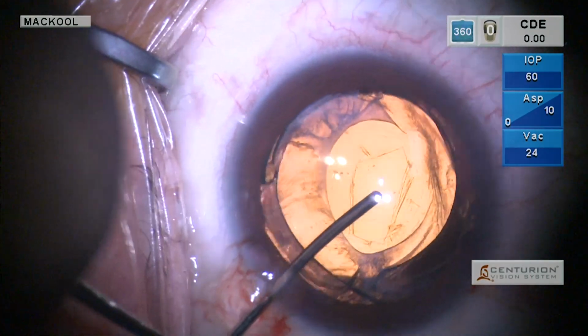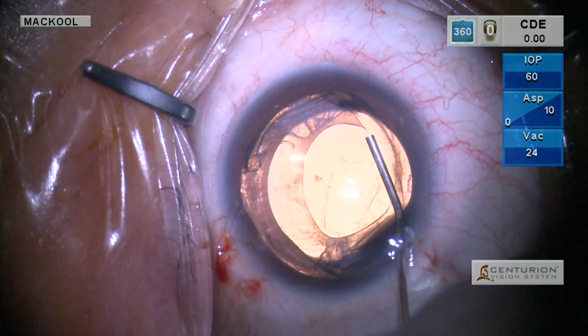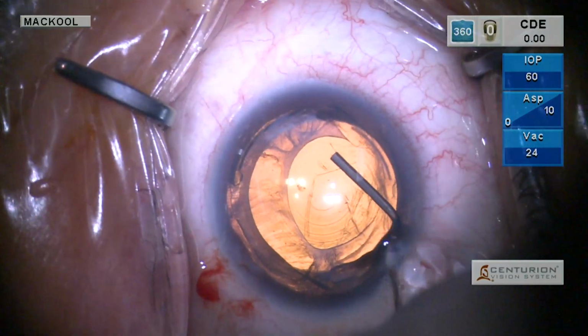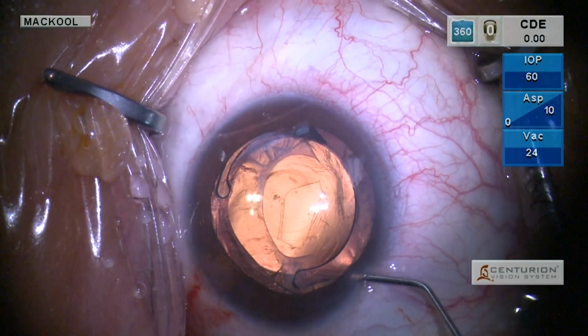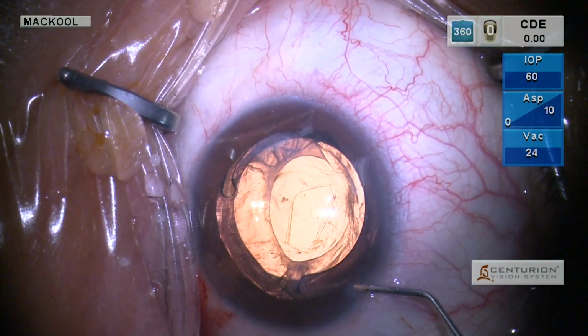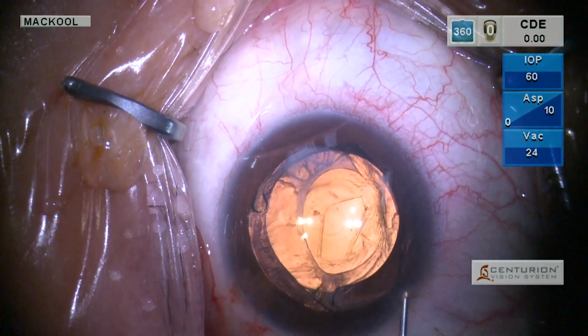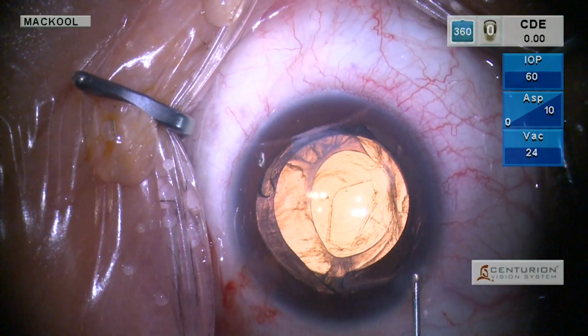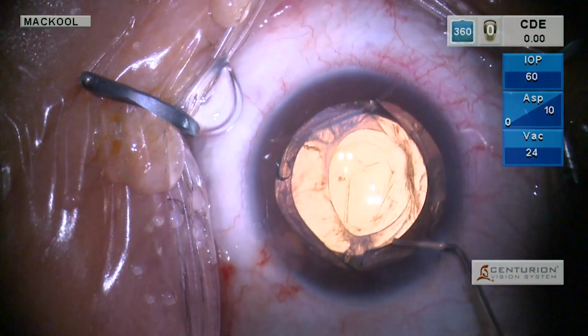So all we've got to do now is irrigate out this OVD and seal these incisions. And I'm going to say that we were a bit on the fortunate side here to be able to accomplish visco-dissection in an eye with an open posterior capsule. A lot of times it just doesn't happen like that.